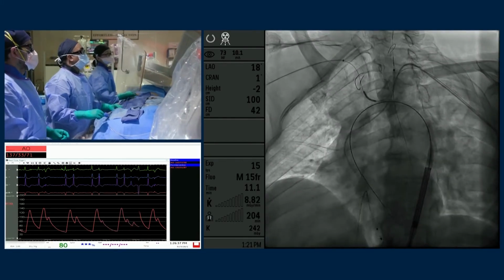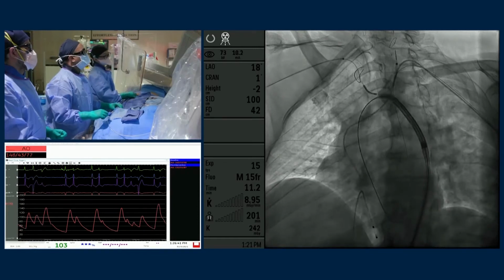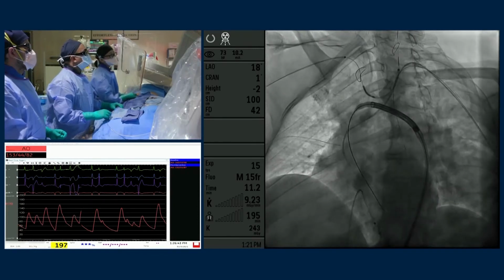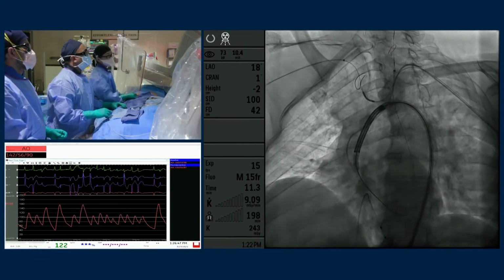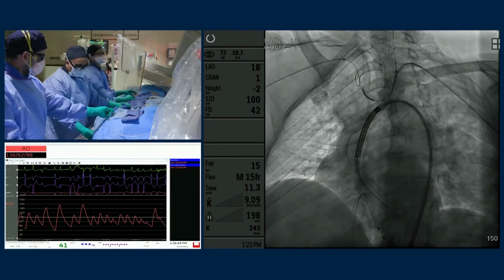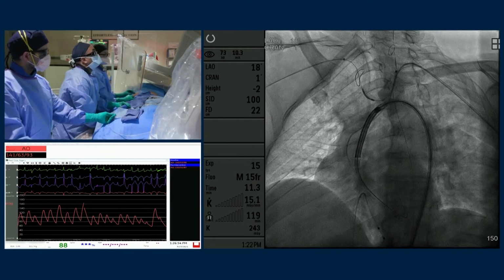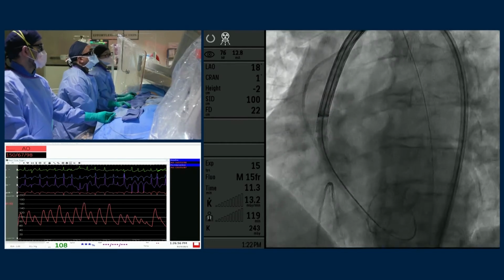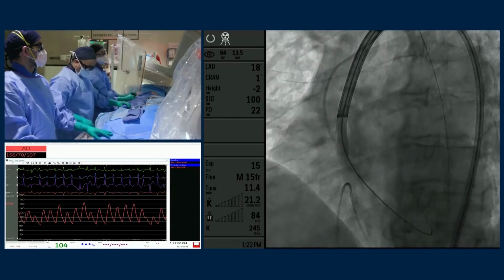Okay, yeah. Great, so you have to usually pull a little bit on the wire at this stage, just to help them come around. Okay, stop there. Let's mag up again. All right. And you can see our hat markers on the outside. That's exactly where we want it to be. Okay.